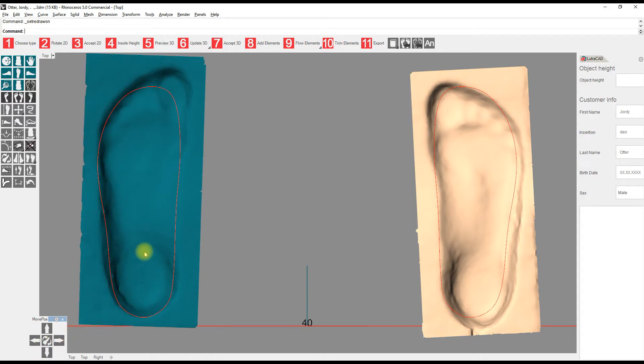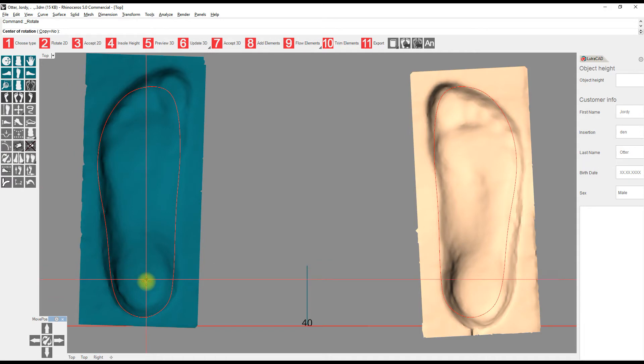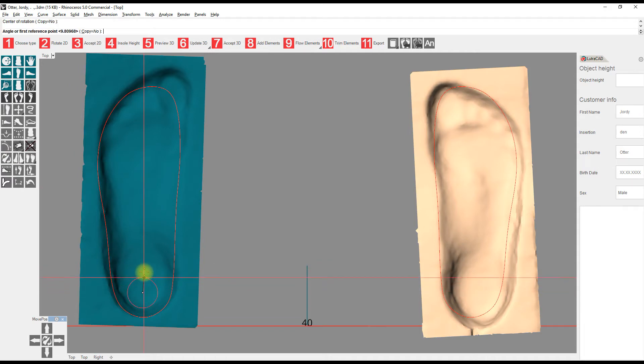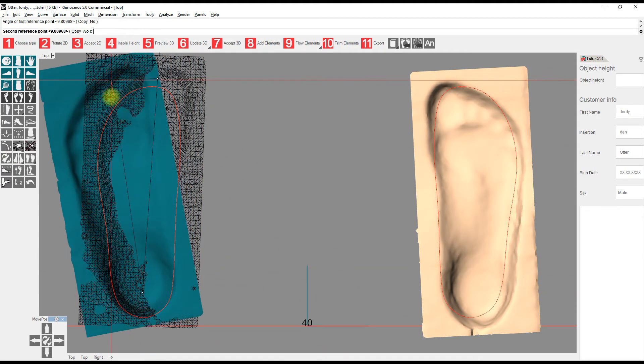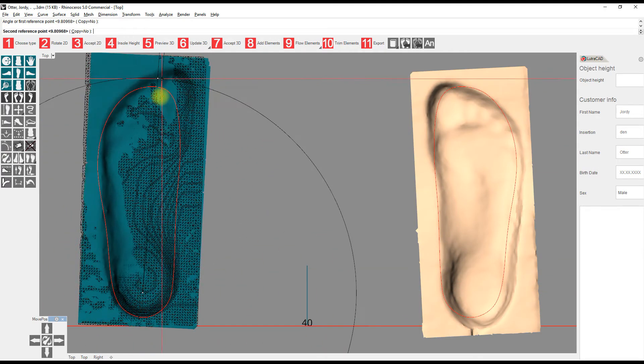It is possible that the scan needs to be rotated as well, which can be done by the rotate button on the left. For this, the software needs 3 points: Center point of rotation, reference point, and end point.